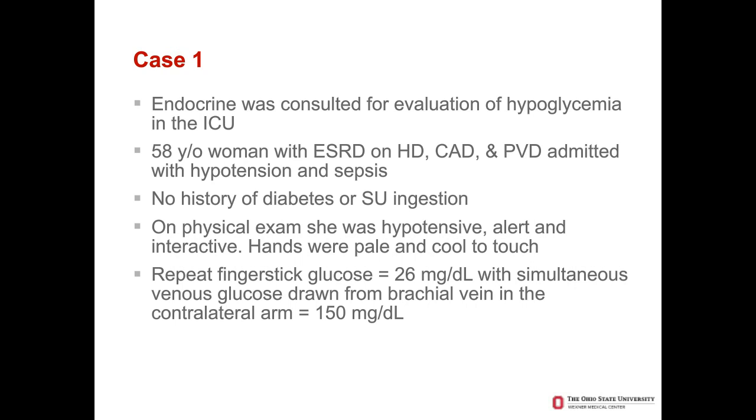When we arrived to the ICU, we found that she was hypotensive but alert and interactive. Her hands were pale and cool to touch. So we asked the question, where did you obtain the blood to check the finger stick? And we were shown which finger on which hand was used for the first and the second and the third, all of which showed very low numbers between 30 and 40. We then did another one, which was also 26.